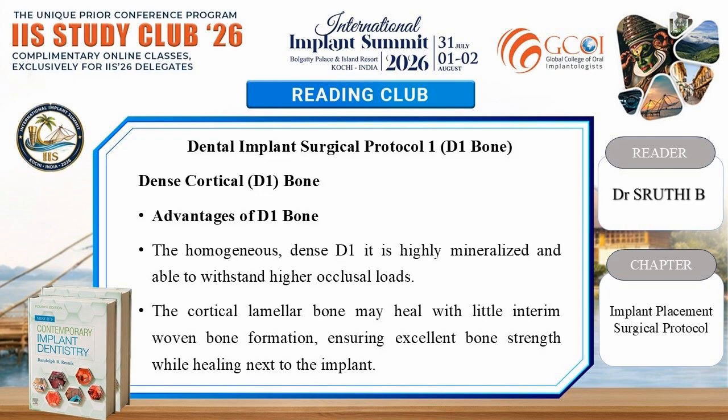Dental implant surgical protocol 1. For D1 bone, dense cortical bone. Advantages of D1 bone. The homogeneous, dense D1 bone is highly mineralized and able to withstand higher occlusal loads.